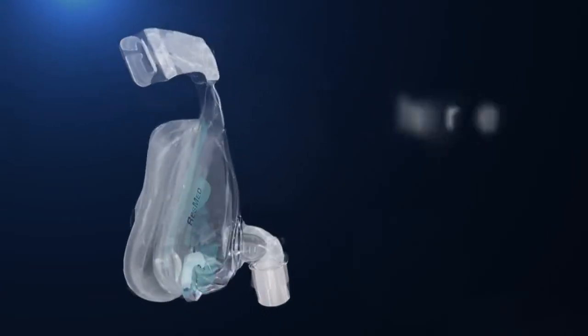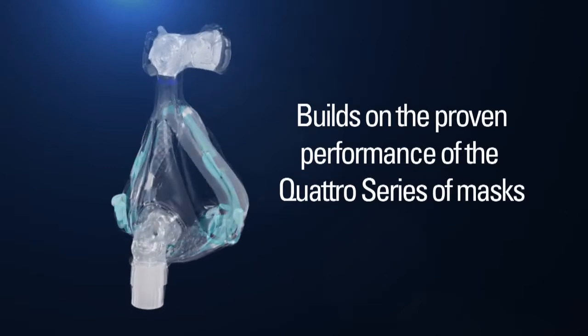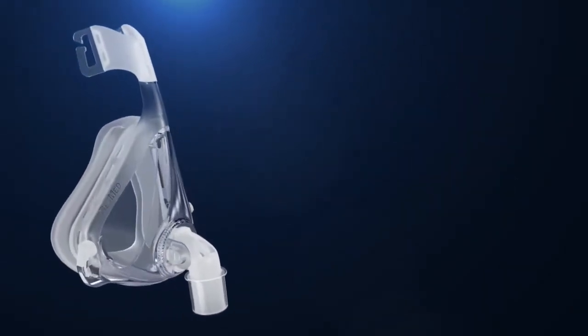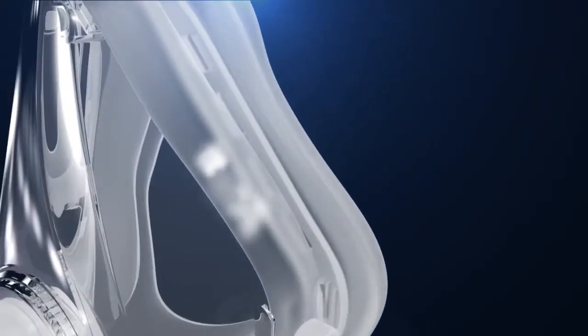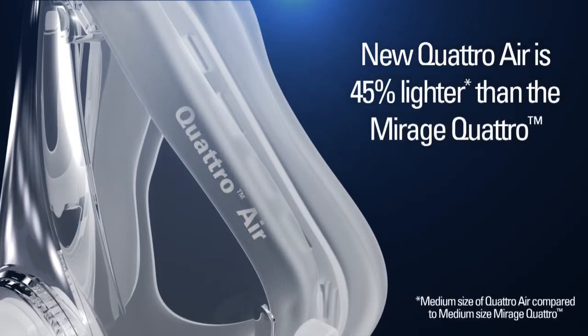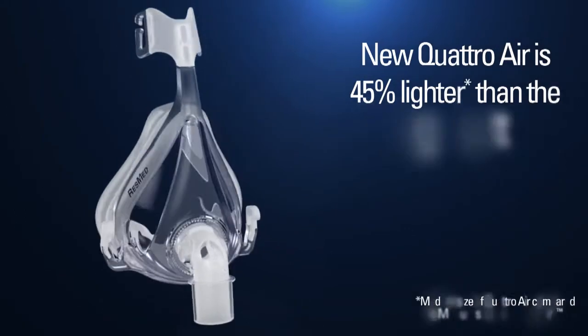ResMed's outstanding Quattro series has earned a reputation for high performance, excellent seal quality, and proven reliability. So it's no surprise that the Quattro series is ResMed's best-selling range of full face masks. And now ResMed has built on all the positives of Quattro masks and cut almost half the weight to create new Quattro Air.